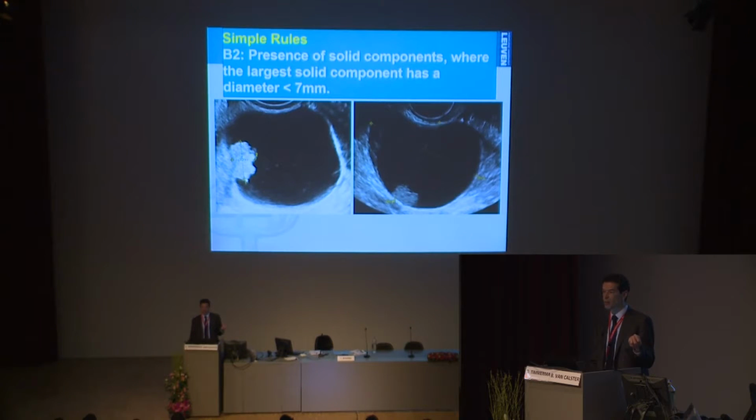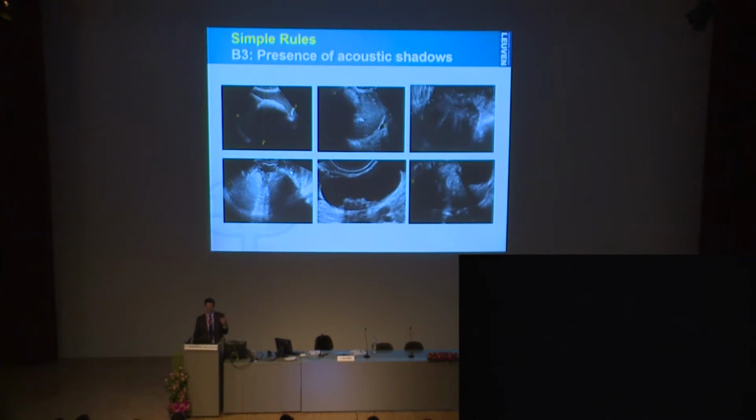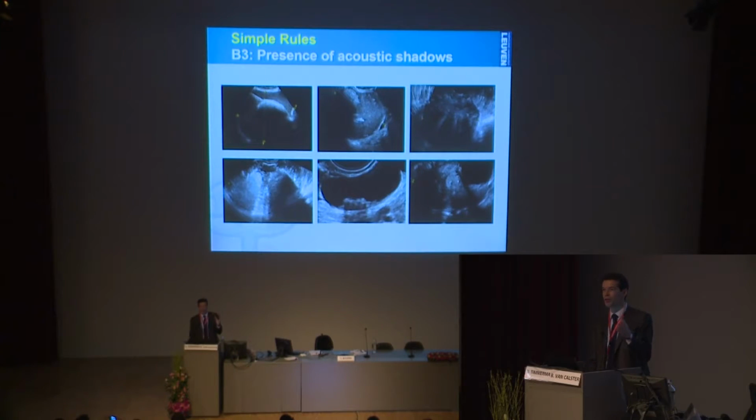That's over 7 millimeters, so this is not suggestive of a benign tumor. If this is 6 millimeters and this is 4 millimeters, then it's a feature of a benign tumor. Okay? If it's too difficult, you have to tell me, but the features as they are, I think, are pretty unequivocal, but sometimes you need to think a little bit about what is really meant with them.